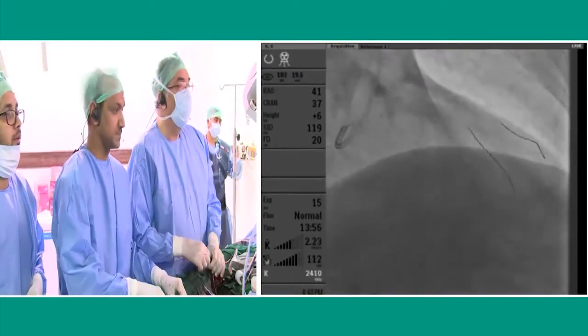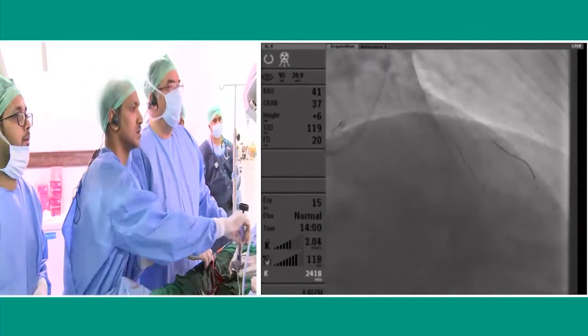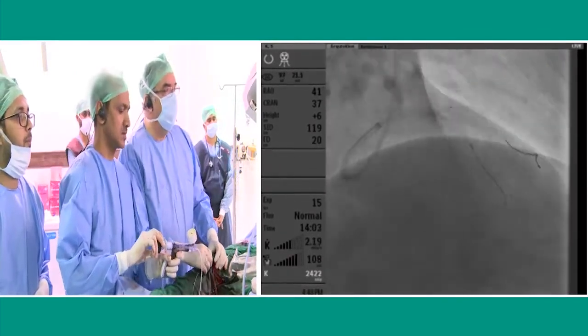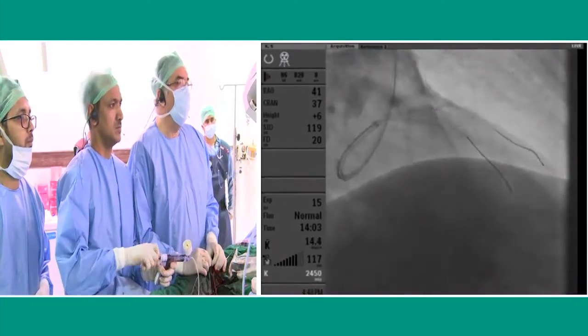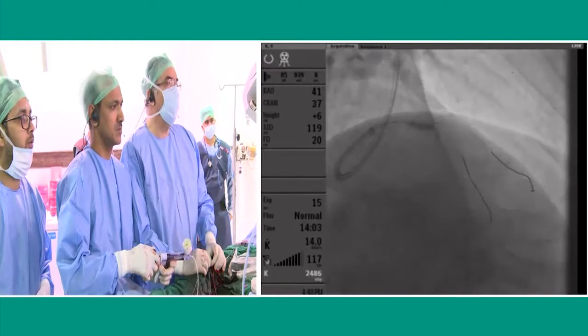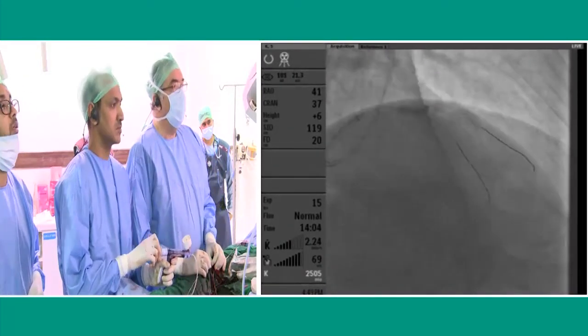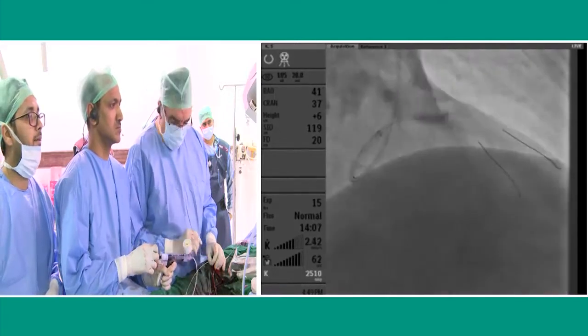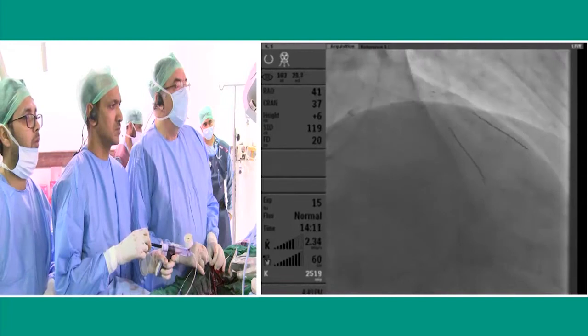You will stay in the same view. Here we are, through the struts, not too bad. Go on, inflation. We are through the struts. 8, 10, 12, 14, 16, 18. We have to open it wide. Stop. Now we can advance again.